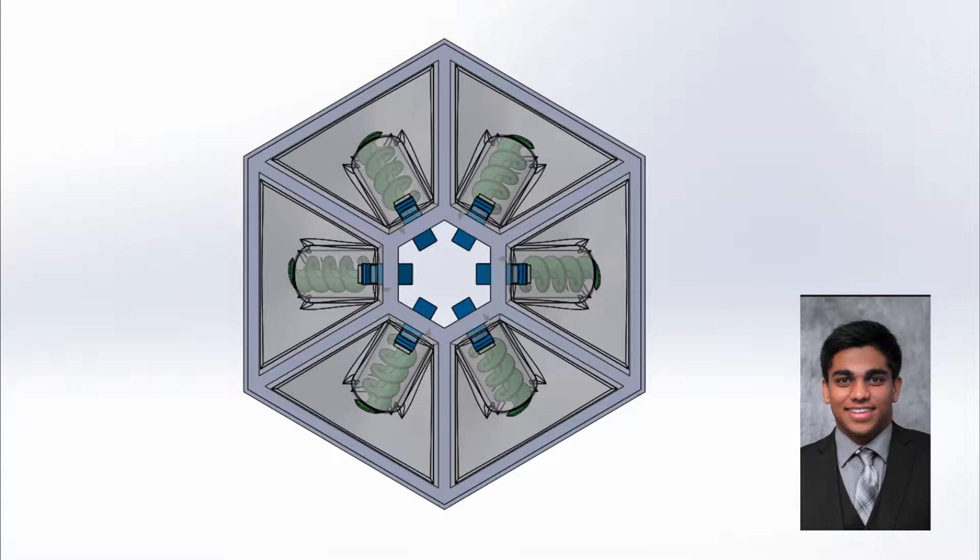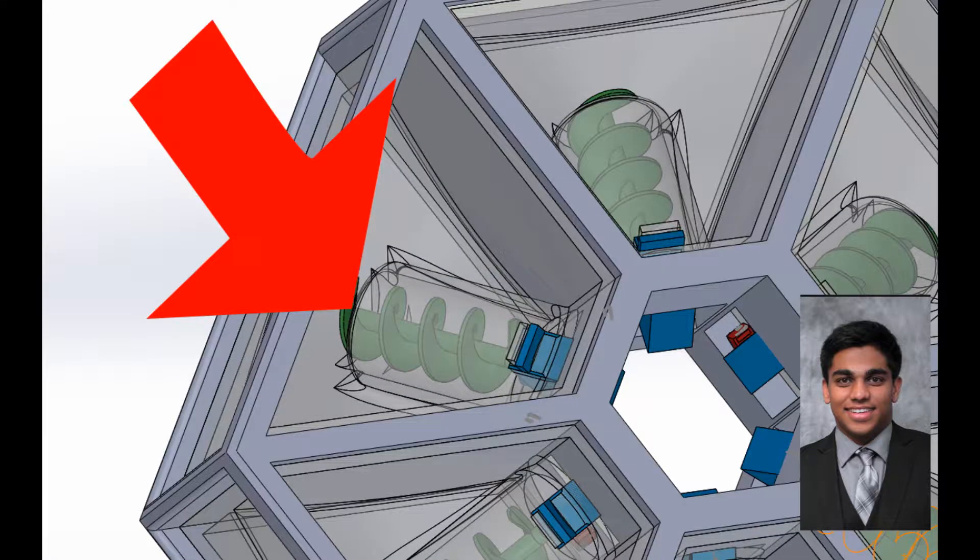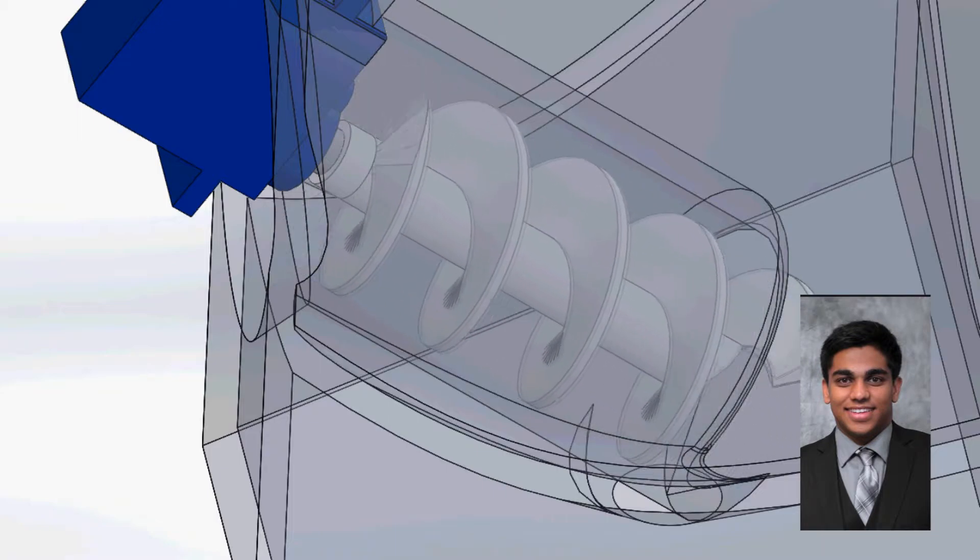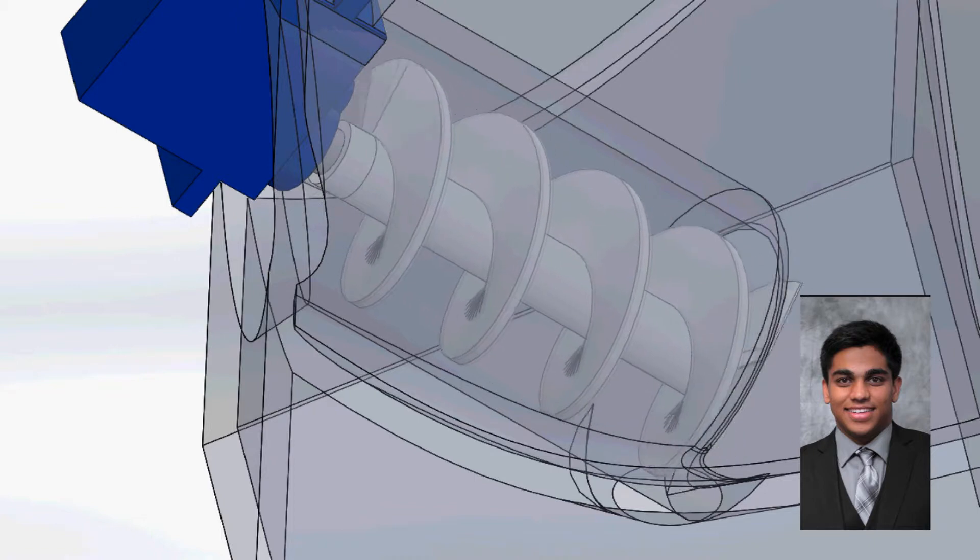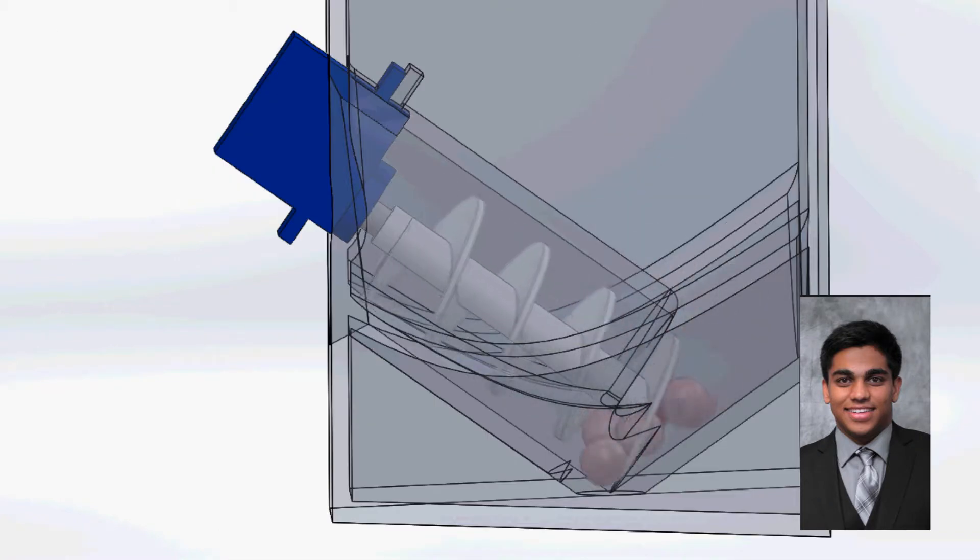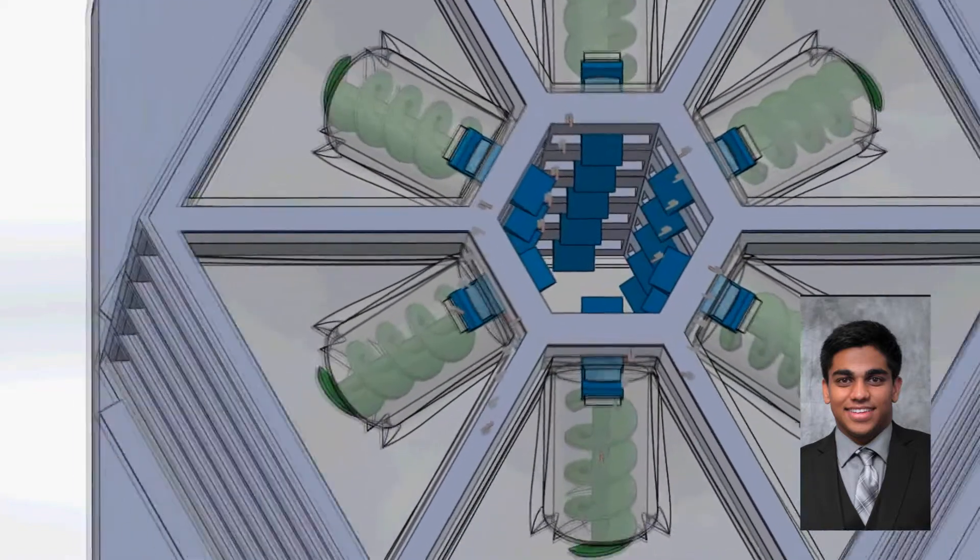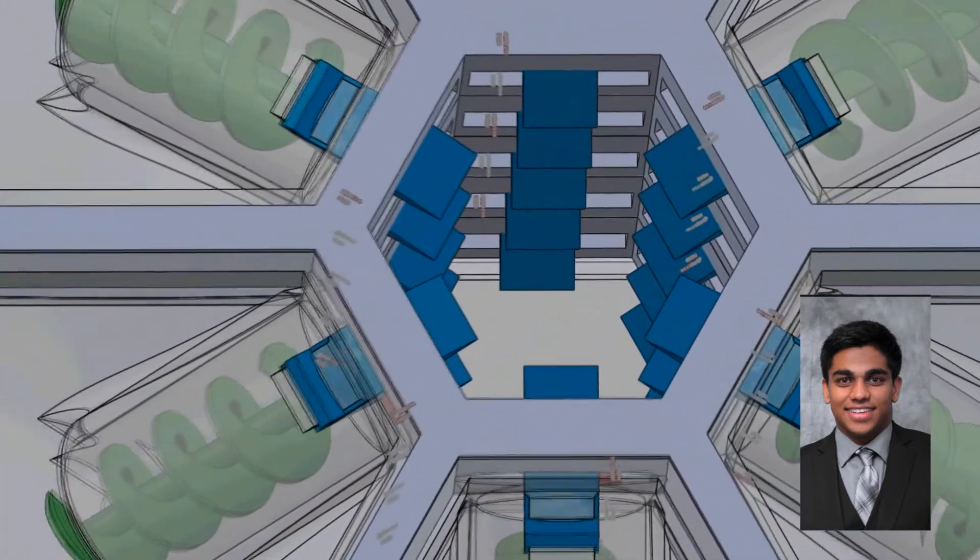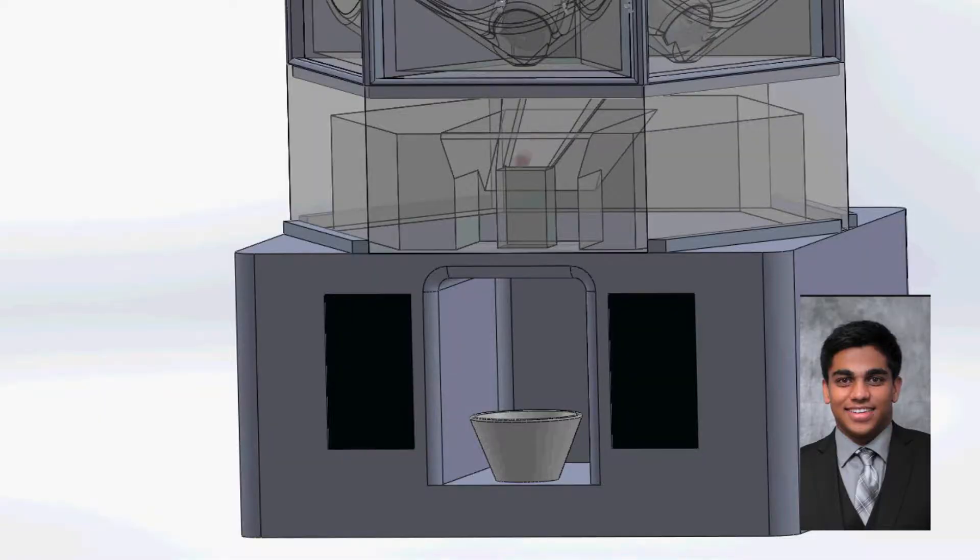All of the components of our product are made using ABS or nylon plastic. There is an Archimedes screw in each of the reservoir housings powered by a DC motor and a microservo body. The motor is connected to the top of the Archimedes screw inside the Archimedes screw sleeve. When required, the Archimedes screw spins clockwise grabbing a pill. The pill travels outward with the Archimedes screw until it can be dispensed into the hexagonal gap. The pill then travels down the path in the top base and falls in a bowl inside the base.